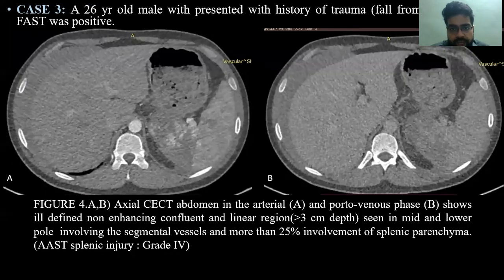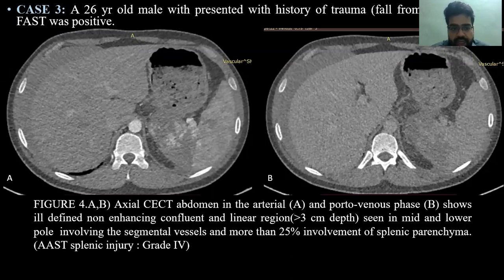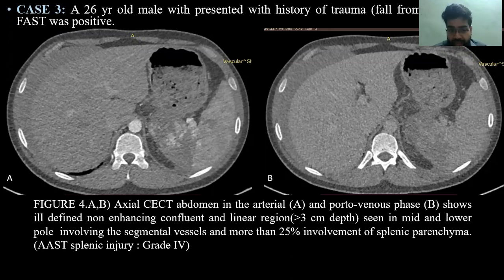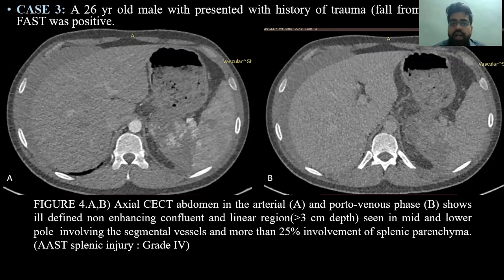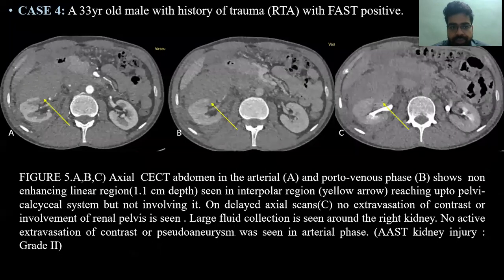Case 3: A 26-year-old male with history of trauma from a fall from height. Axial CECT in the arterial and portal venous phases shows ill-defined non-enhancing confluent linear regions with depth more than 3 cm, involving the mid and lower pole, and longer segmental vessels with more than 25% devascularization of the splenic parenchyma. This was graded as AAST splenic injury grade 4.